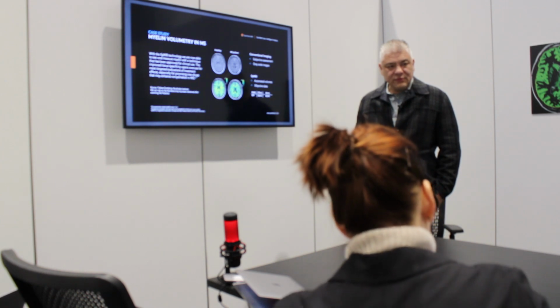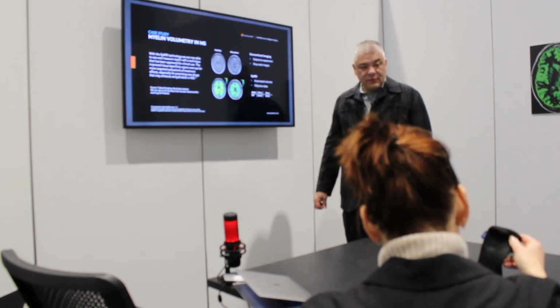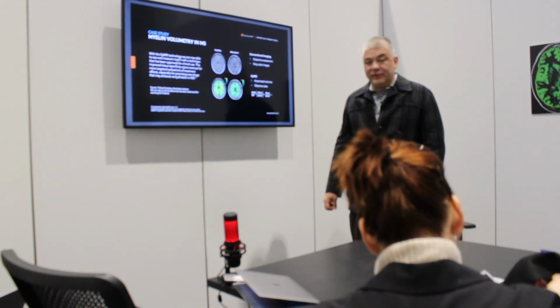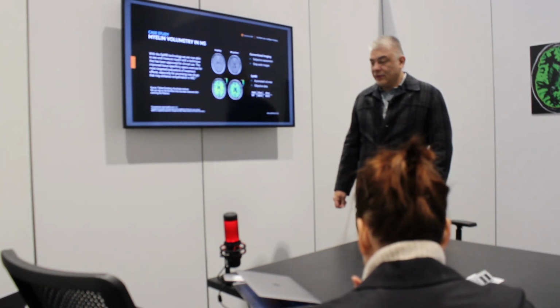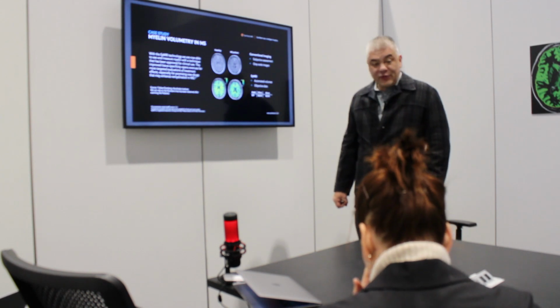Could you comment on that, or reliable? This is very reliable. Impressive. You see a degradation of the myelin, even in areas where there are currently no lesions.